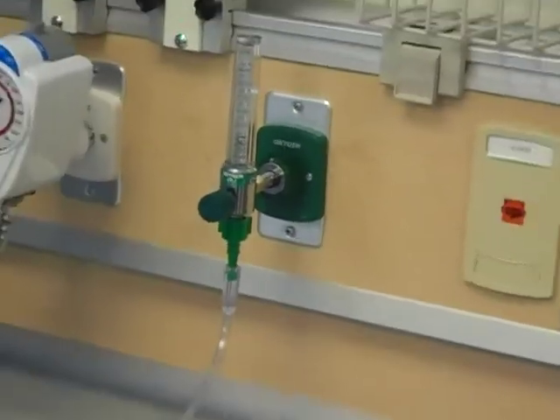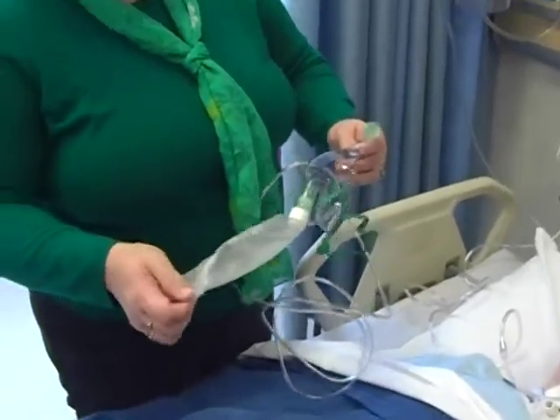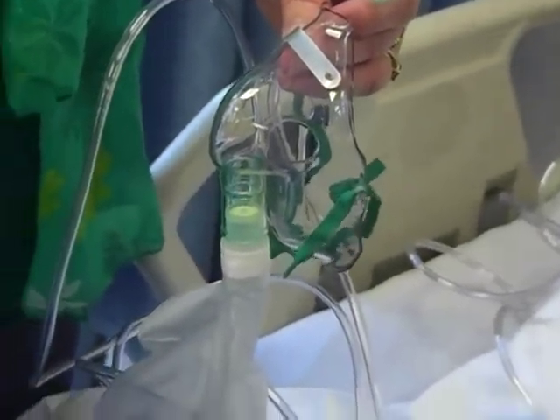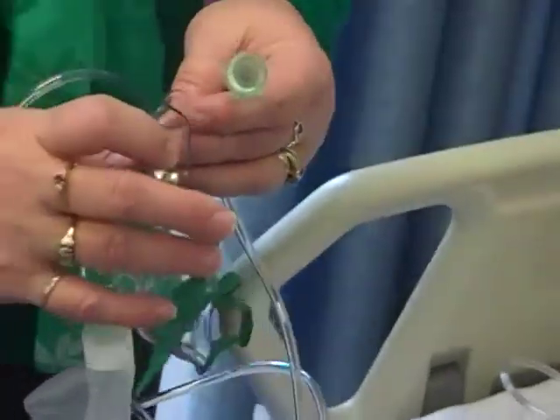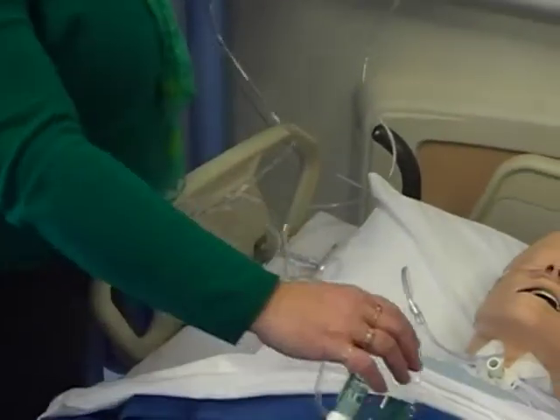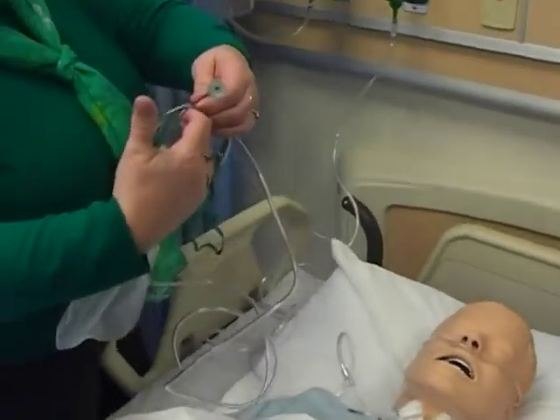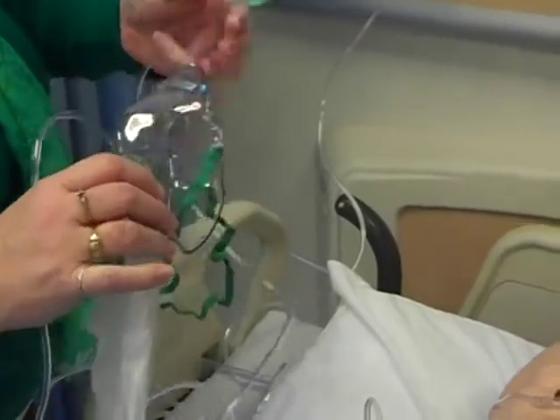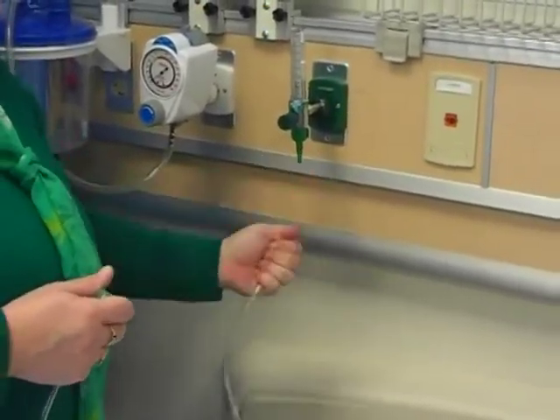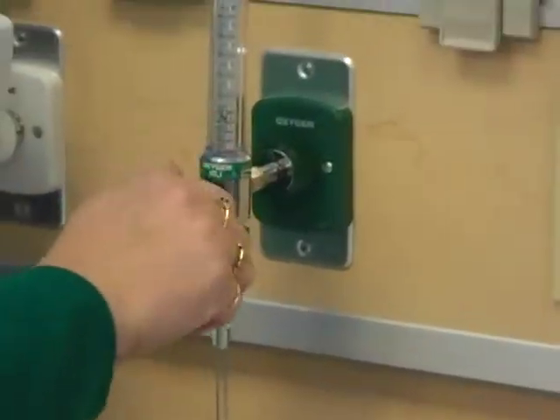If your patient is requiring more and more oxygen and the nasal cannula isn't working, we have what we call a non-rebreather mask. There are venti masks and all other kinds of masks, but I'm not going to get into those right now because that's really respiratory therapy's area. We're mainly concerned with using a non-rebreather and a nasal cannula. With the 100% non-rebreather, the patient is going to have it on their face and breathe in the oxygen that's in the bag. You need to have the flow rate up to at least 10, preferably 15 liters a minute. You stick that on the oxygen flow meter on the wall and turn it way up.